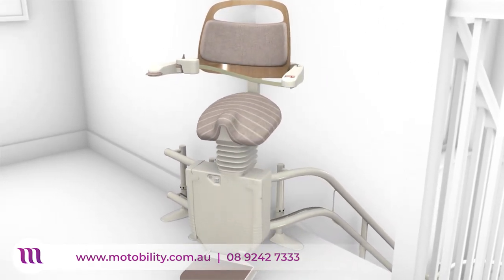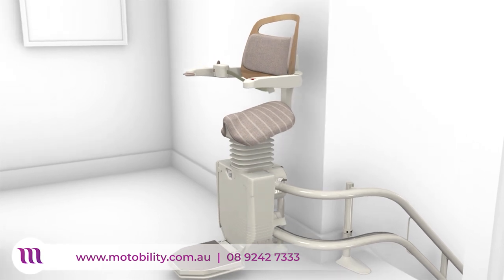Sensors automatically detect any obstruction on your stairs, bringing your Sadler stairlift to an immediate stop.